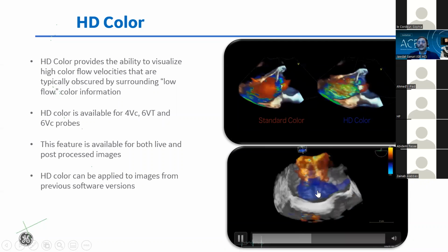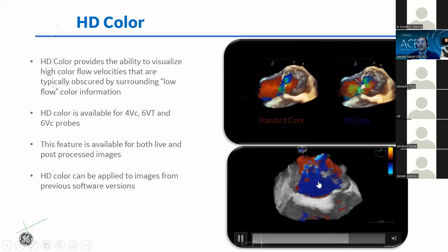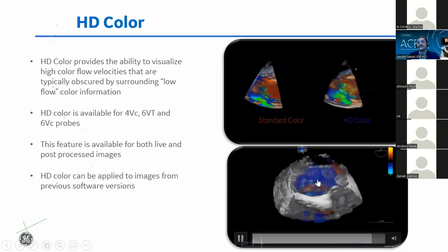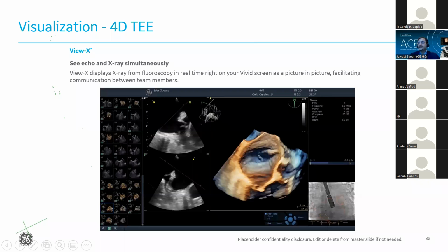Likewise, here in the mitral structure, on the left it's inactive. You can see the blue obscuring my vision of the regurg, and on the right it's active. And you can see now 3 distinct regurgitant jets across this mitral valve, hence helping us visualize better.